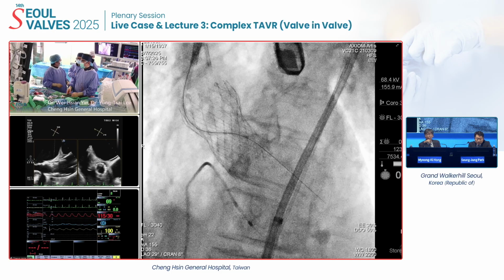How do we realize that the unicorn procedure was successfully done or not? Or how do we evaluate the efficacy? TE.